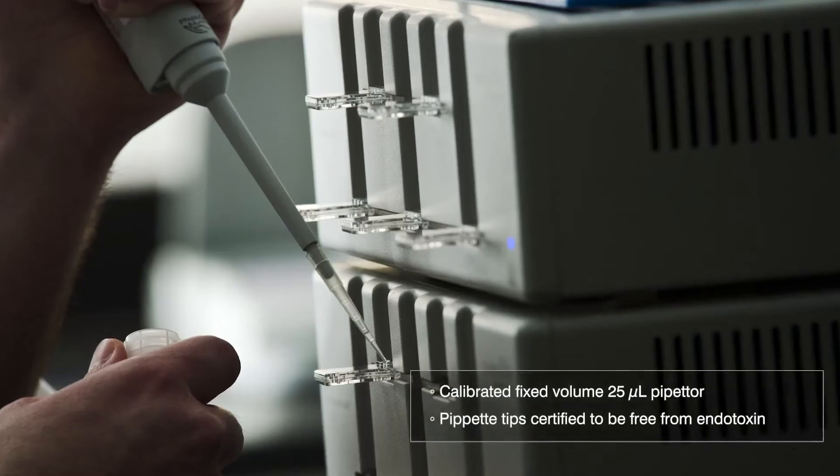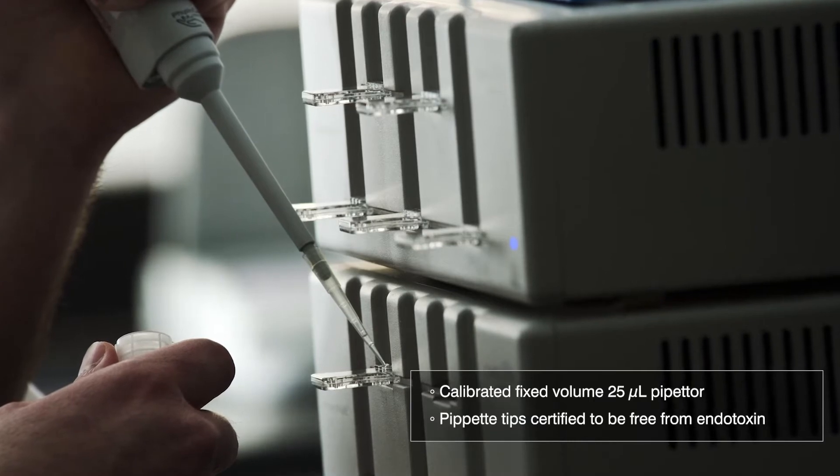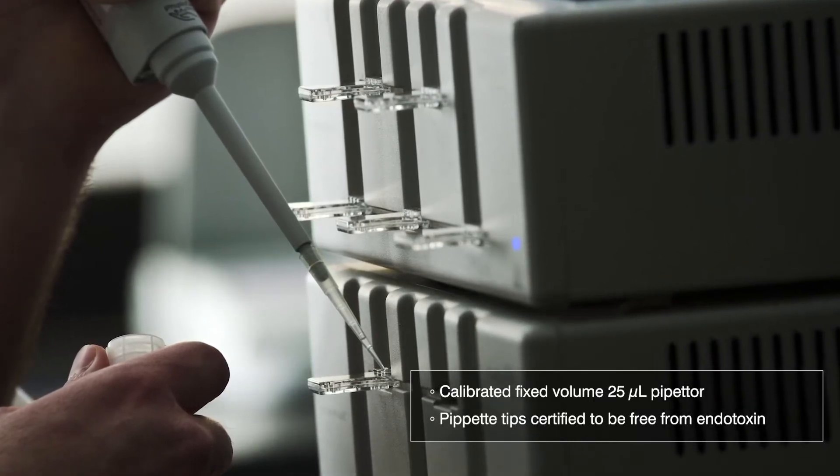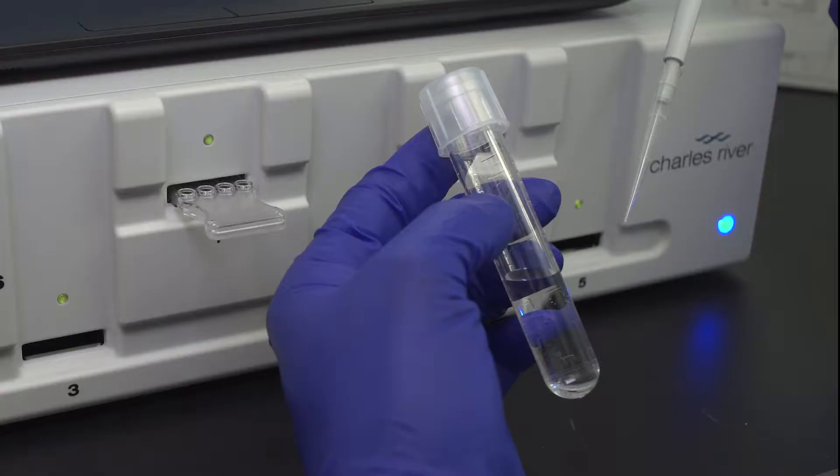In addition to your NextGen MCS reader, to begin testing, you will need a calibrated fixed-volume 25-micro-liter pipetter, pipette tips certified to be free from endotoxin, EndoSafe cartridges with the certificate of analysis, and your sample.